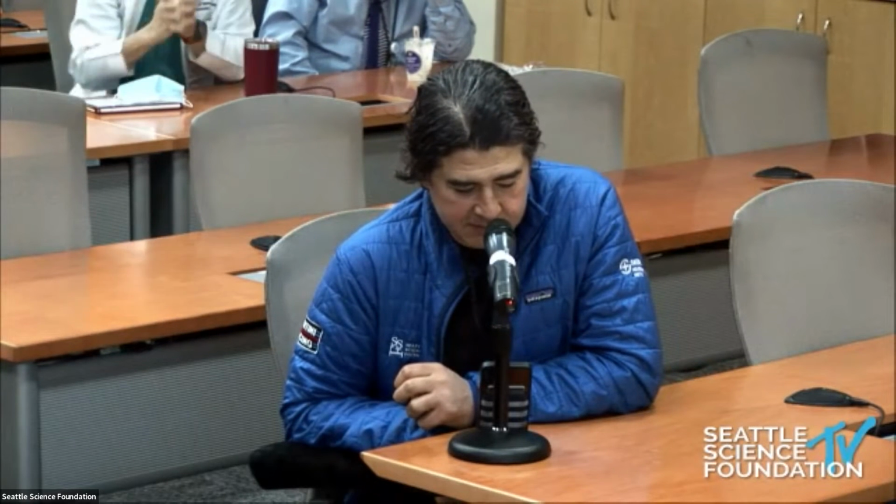We have a hard time, and I'm sure you don't have this problem in New York City, getting really good scoliosis x-rays in these patients. What do you guys do at your center? Do you guys have an EOS? Yeah, we get EOS for all these patients. Pretty much before surgery, everyone gets EOS. Even our smaller fusions will get EOS before surgery. And even cervical, I typically get EOS to see what the overall alignment is like and to make sure that the deformity isn't somewhere else.